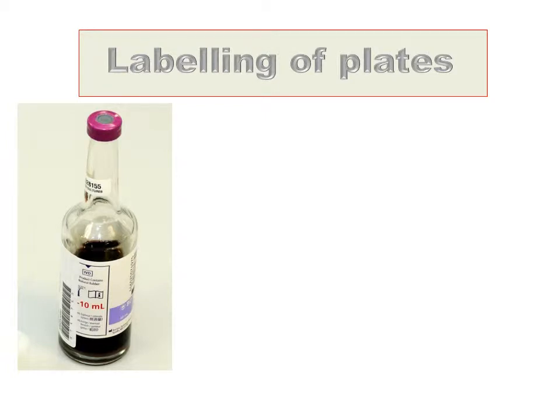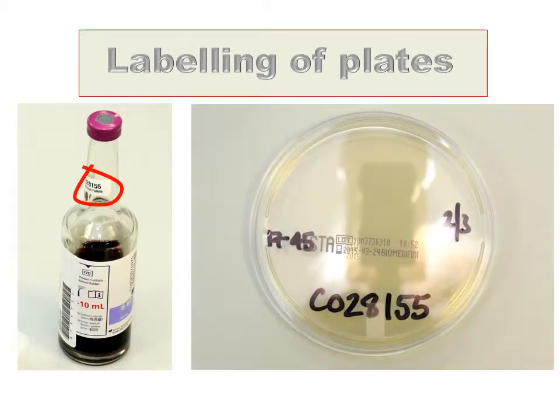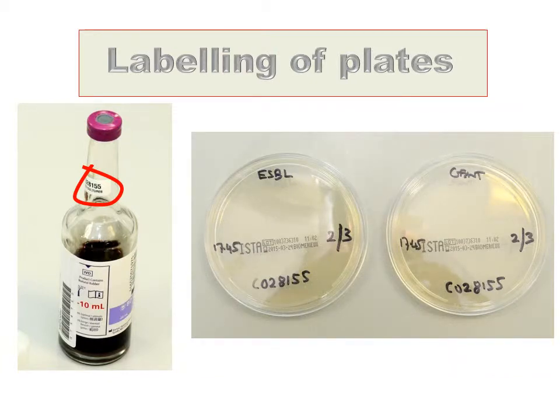The initial step is to label the plates. On the neck of the blood culture bottle should be a sticky label with a C number. The C number should be placed at the bottom of the plate together with the date and the time of the subculture. On two of the sensitivity plates, these are labelled ISTA — also mark at the top of the plate ESBL and gent.